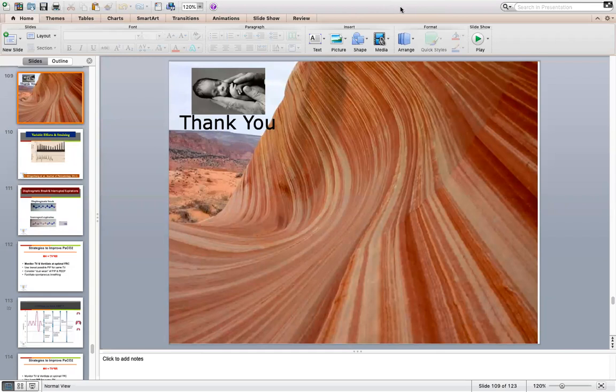And when you select numbers and modes, 30 minutes later, after 10 minutes, everything will change, because ventilation is dynamic and your settings should be dynamic. You should never depend on numbers. You should never give remote orders. Those people who are caring for these babies 24 hours should know what they're doing when looking at these numbers. You don't need to go deep into it, but at least general principles would help you to ventilate. Now, I'm not saying that doing gas is something bad, but you should not depend only on the gas. These monitors have beautiful loops and graphics and many numbers, and you need to use them. So this lecture was very important and needed lots of training and discussion.